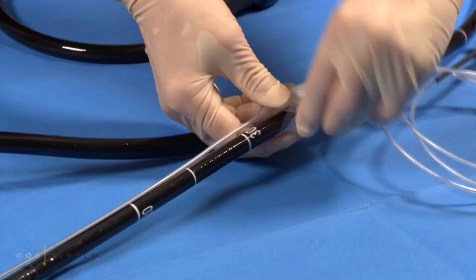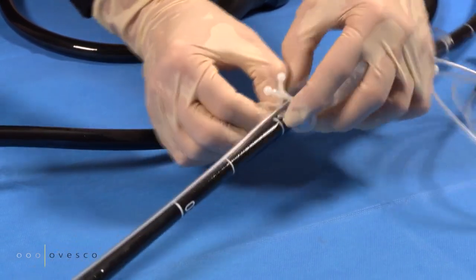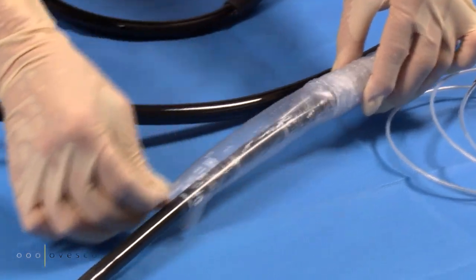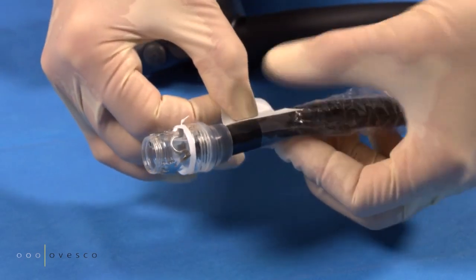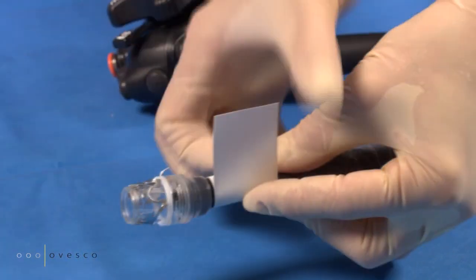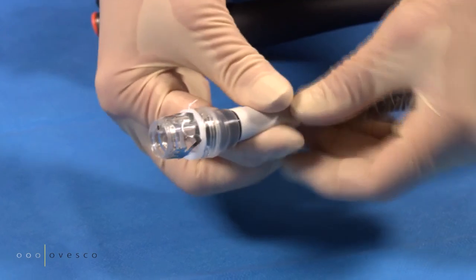Move the endoscope sleeve towards the cap and remove the plastic clamp on the proximal side. Tape the end of the sleeve to the endoscope shortly above the application cap using the included tape. The tape must not touch neither the hard nor the soft part of the application cap.